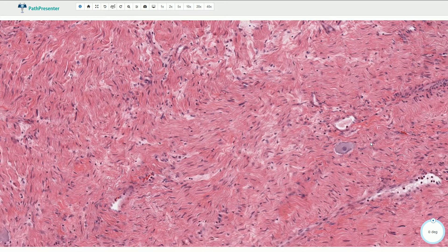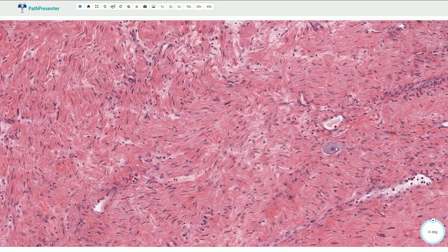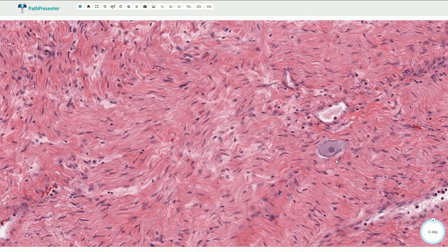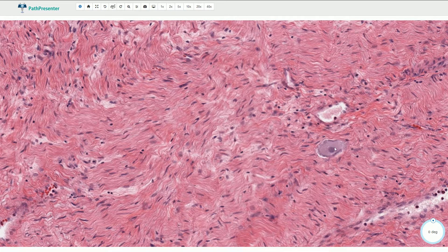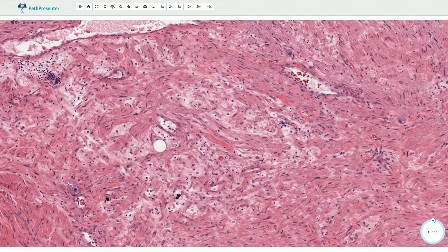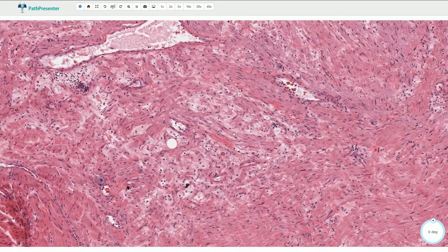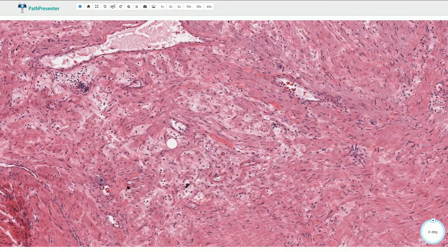The second component is formed by these mature ganglion cells. They have slightly basophilic voluminous cytoplasm and a centrally located bland nucleus. Similar ganglion cells are also present here and here. The stroma can sometimes have a myxoid appearance, at least focally, as here for example.